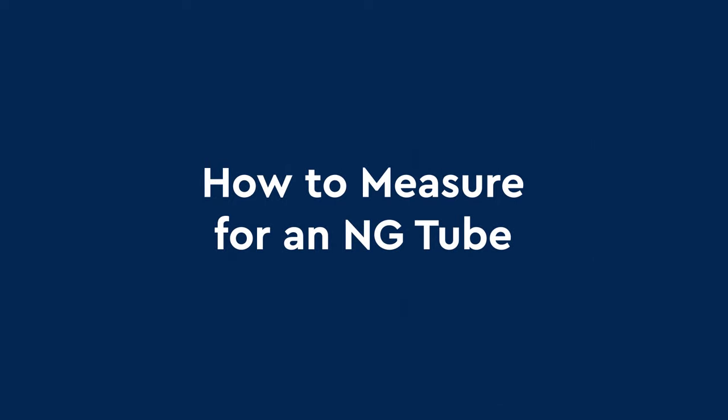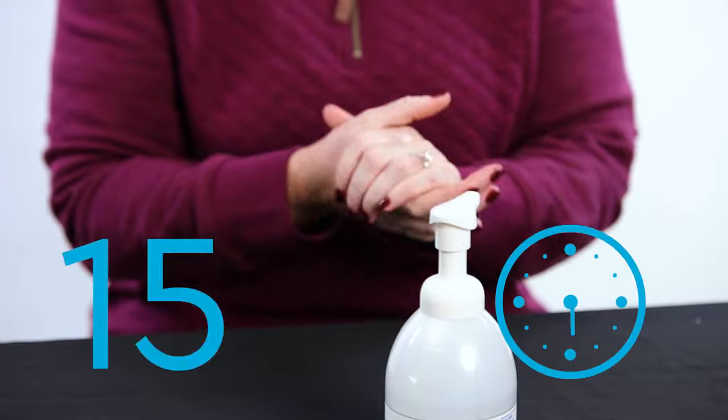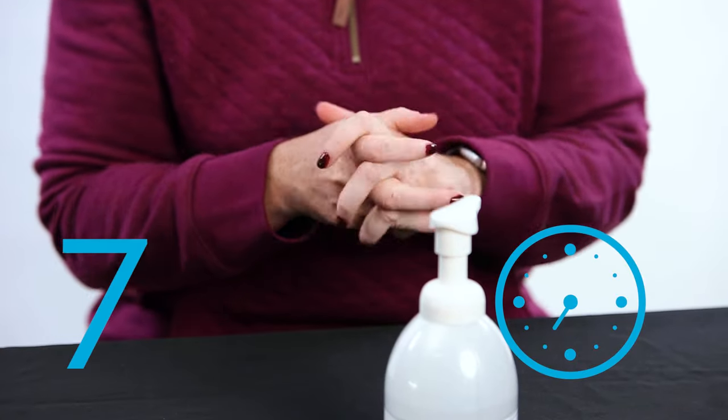How to measure for an NG tube. These are the supplies you will need to measure a new NG tube. Before touching the NG tube, wash your hands for 15 seconds or use hand sanitizer.